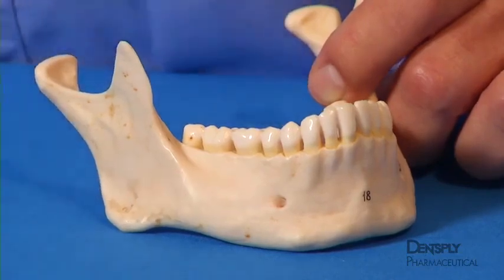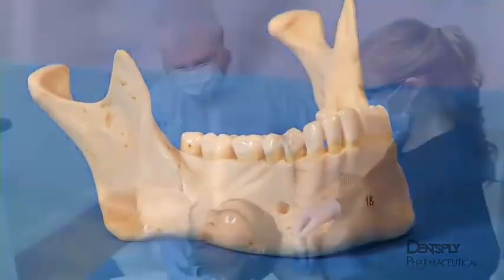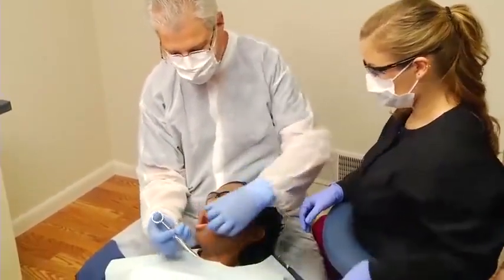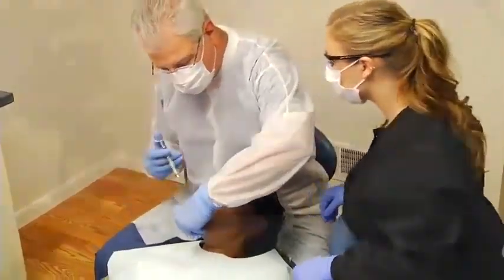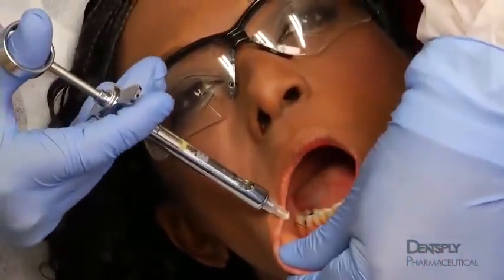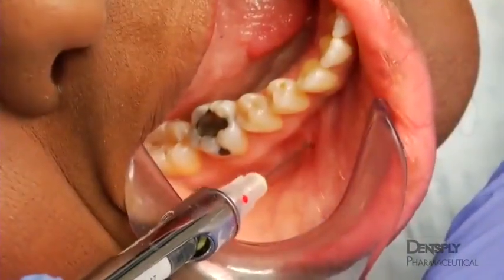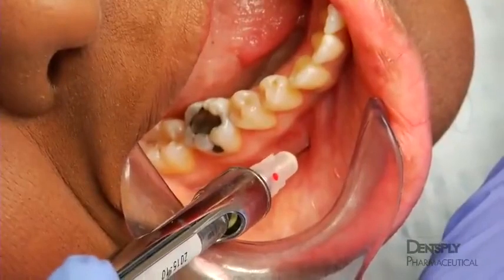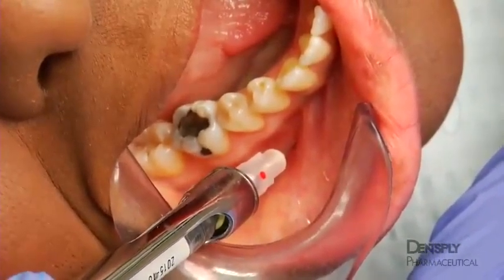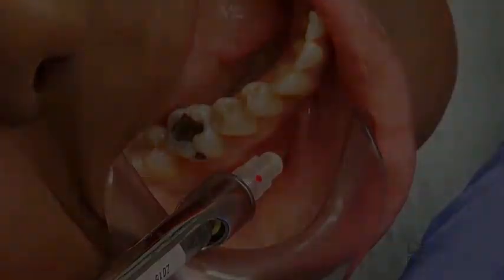For a successful mental nerve block, there is no need to penetrate the mental foramen with the needle. This injection is best accomplished with the clinician positioned behind the patient. The lip is retracted between the thumb and forefinger, and the foramen is located. With the tissue pulled taut, penetrate the buccal vestibule adjacent to the second premolar, advance the needle 5 to 6 millimeters, aspirate, and slowly deposit about 1/3 of the dental cartridge.